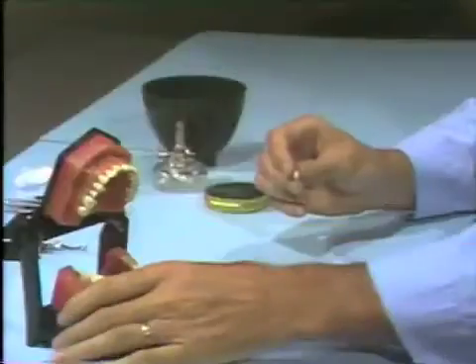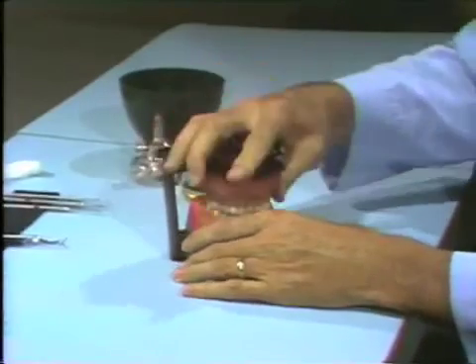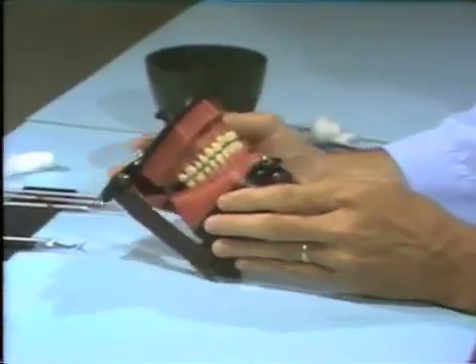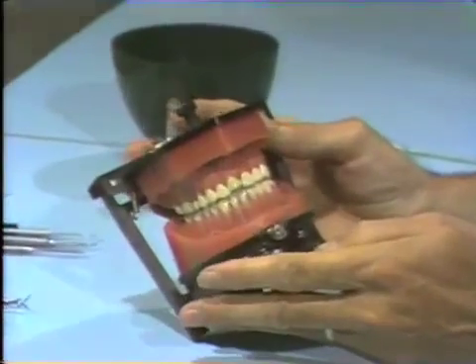Then we should go back and place it into our typodont, make sure it's seated, and then examine it as it relates to the contour of the surrounding teeth, the cuspid and the second bicuspid.